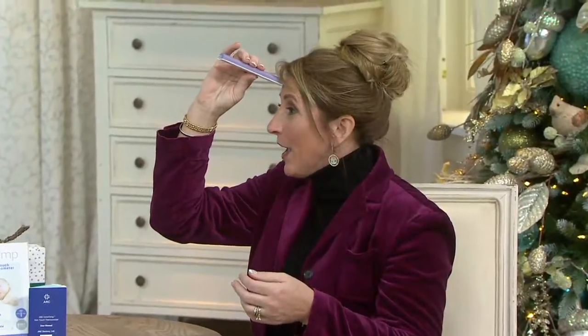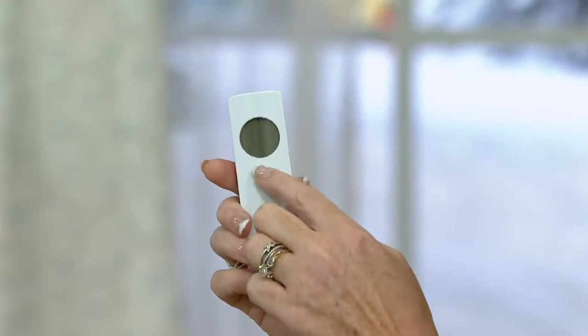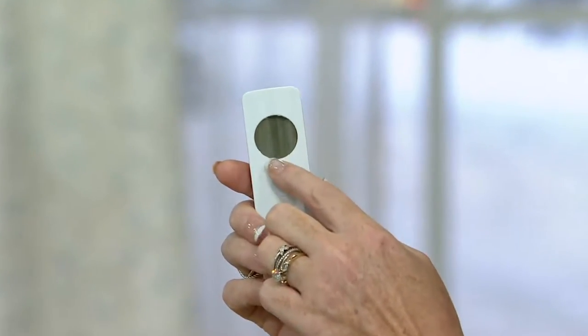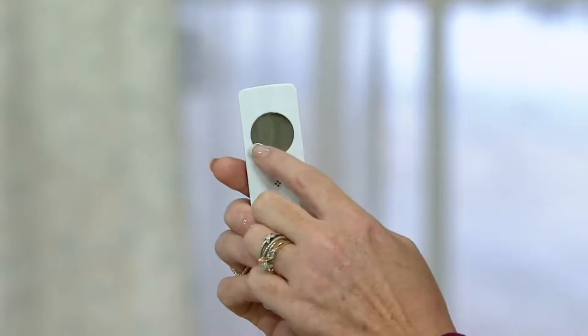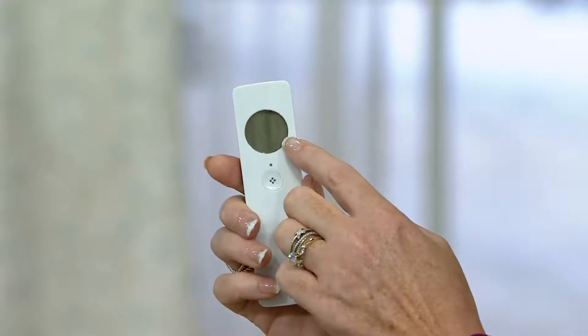It just takes the human temperature. You have to be no further than an inch from the forehead and there's a little button right here. You just literally push this button for just an instant. If you push it too long, it'll let you know. It will backlight so that you can read this in the dark. The screen is an inch long and an inch wide, so it's very big and easy to read.